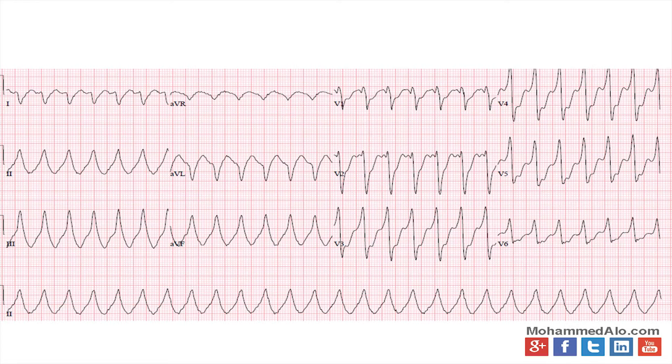Next slide here. This is definitely VTAC. There's absolutely no RS complexes, very wide, very regular. If you did find the P waves, they'd be AV dissociation. Don't really see that because it's hard. But this is clearly VTAC.